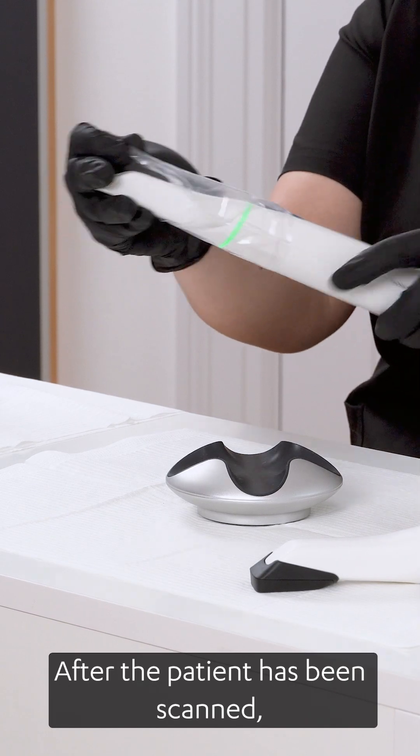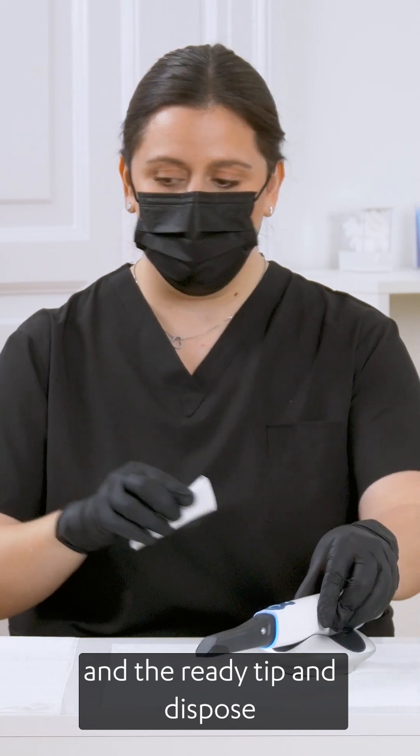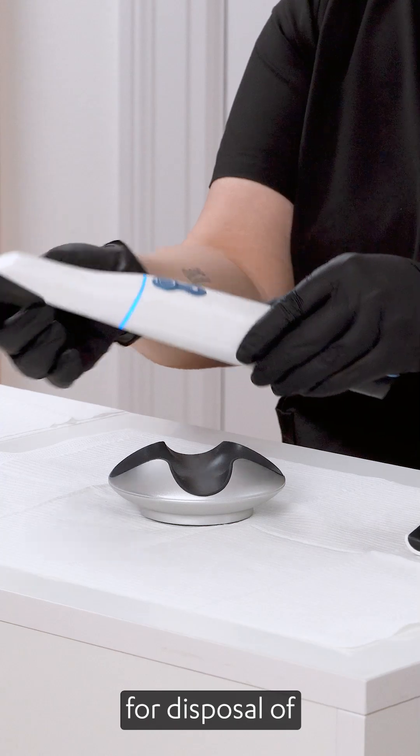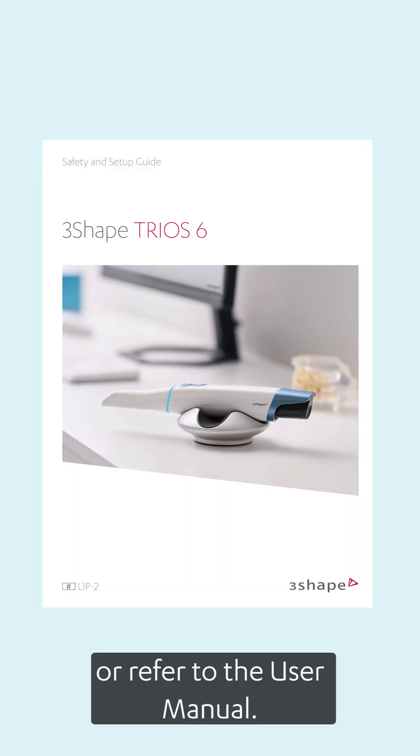After the patient has been scanned, remove the used sleeve and the Ready tip and dispose according to standard operating procedures or local regulations for disposal of contaminated medical waste. For more details, visit 3Shape Community or refer to the user manual.